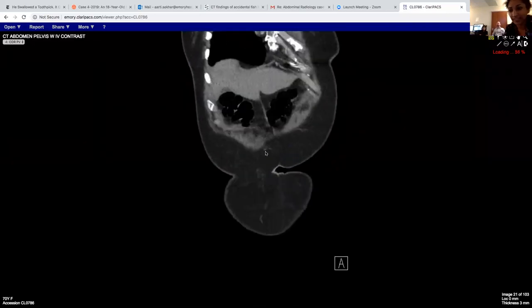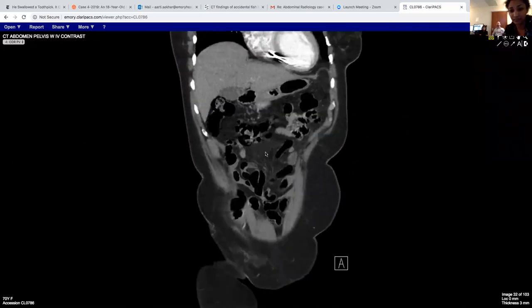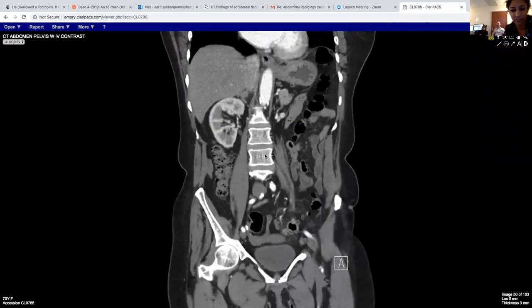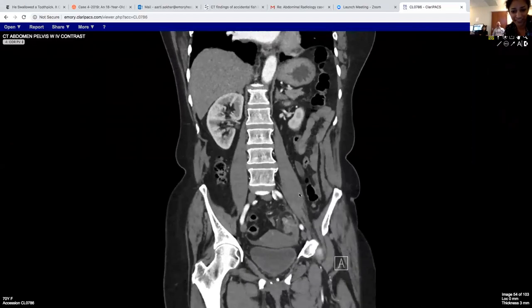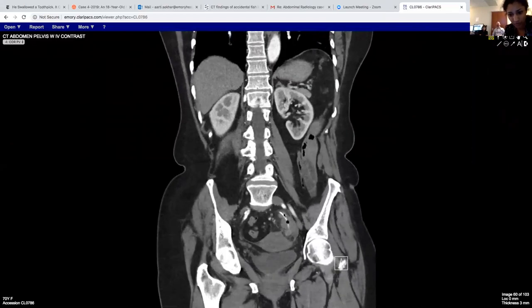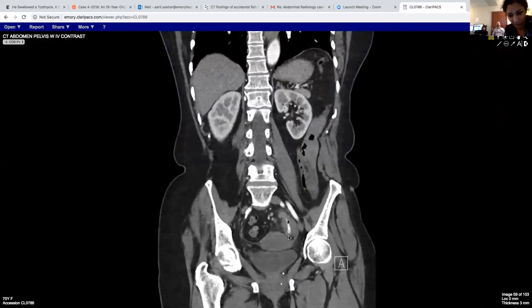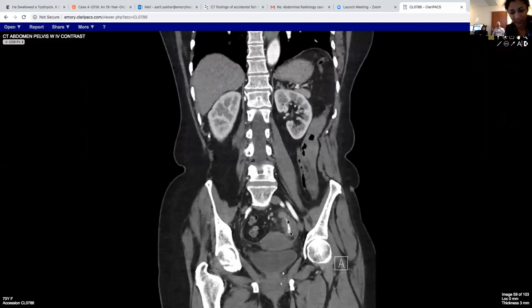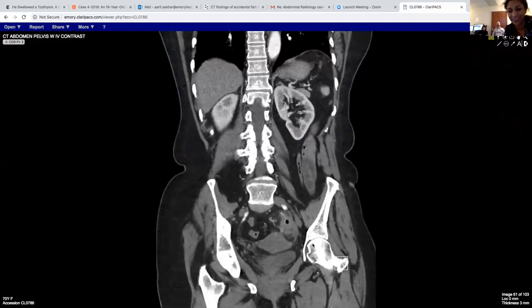Apparently in Atlanta, people are just gobbling up fish bones. This one — the patient had diverticulitis, and this is a huge bone here, and it's actually going into two different diverticula — so it's wedged in two diverticula of the sigmoid colon.